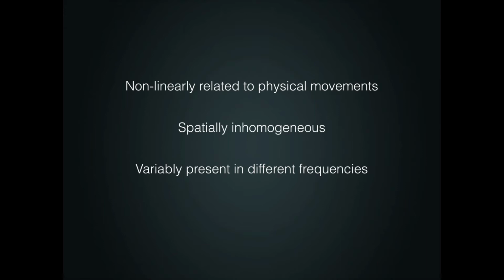And you'd expect those to be seen in high and low frequencies. So modelling these artifacts is near impossible. But the one thing they do have in common is that they are non-stationary. And the non-stationarities caused by motion artifacts are larger than the endogenous non-stationary fluctuations. And this is actually the fundamental assumption behind wavelet despiking.